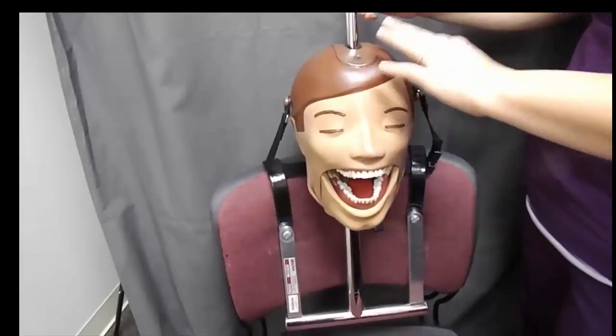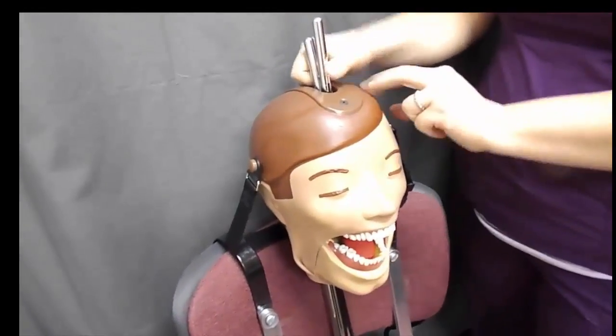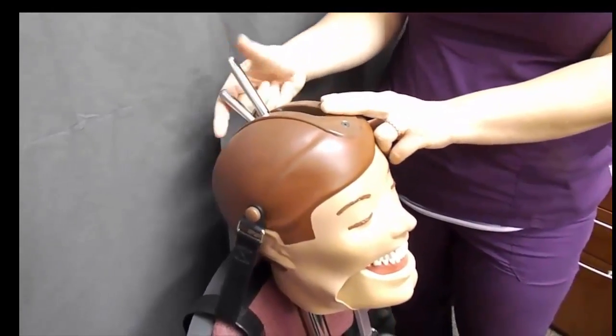In this video we are going to use Dexter to demonstrate the placement of mandibular anterior PAs. This instrument will allow you to image from first premolar to first premolar in the mandible.